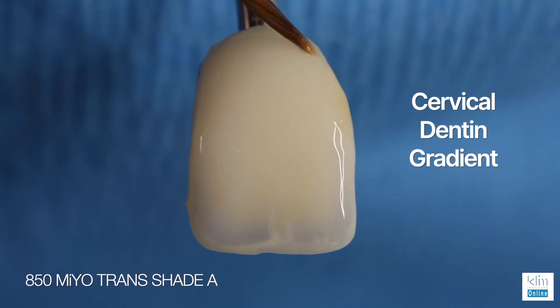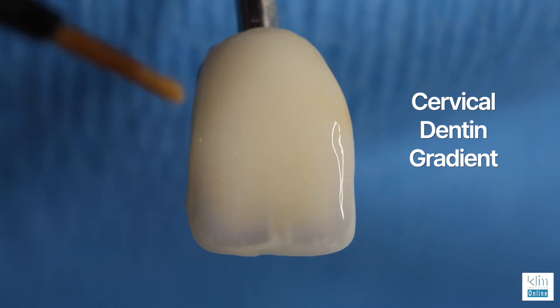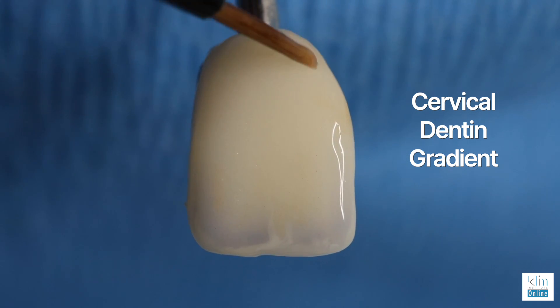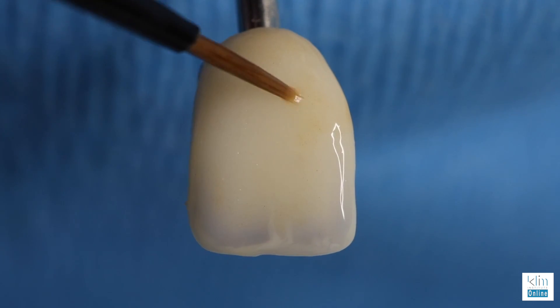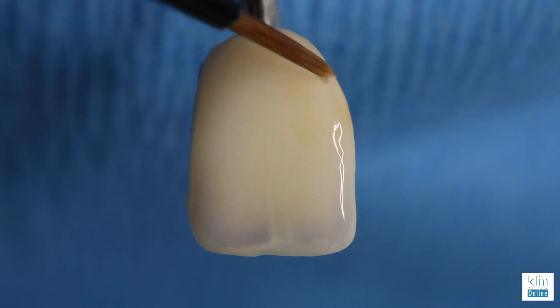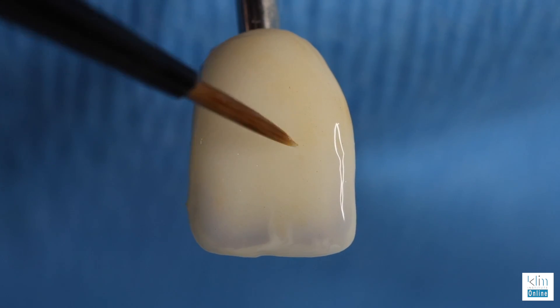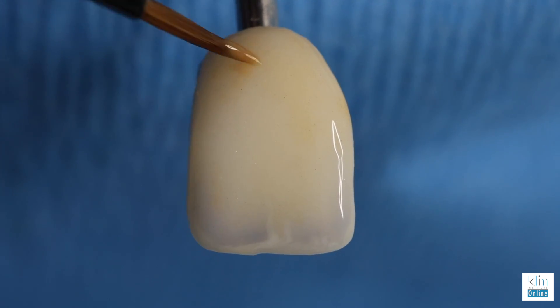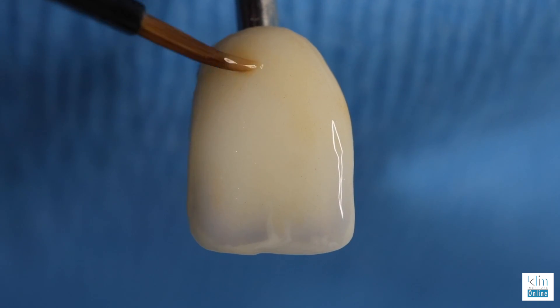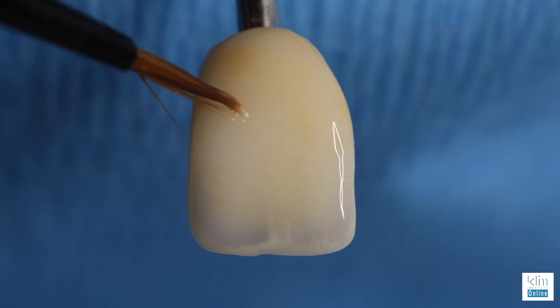There are different ways to apply the cervical dentinal shine-through of a ceramic. I prefer using a more translucent ceramic when it applies and letting the prep color shine through. However, with Mio cervical colors, we have the dentinal shades. One nice thing about this material is that we can create a subtle gradation without blotching — one application, no blotching. It's really nice to have this feature as support when adding the subtle effects needed for the case.